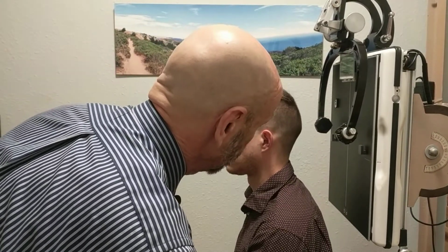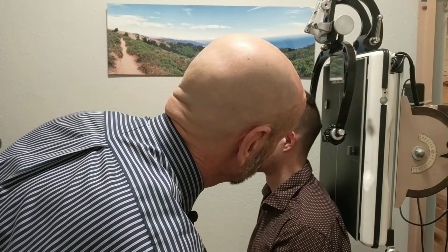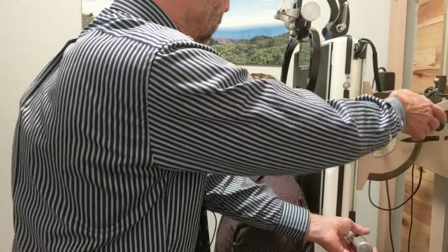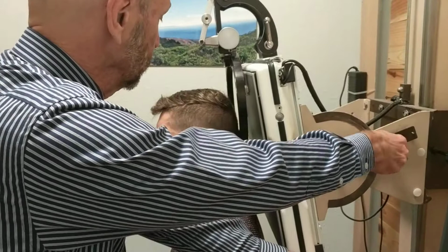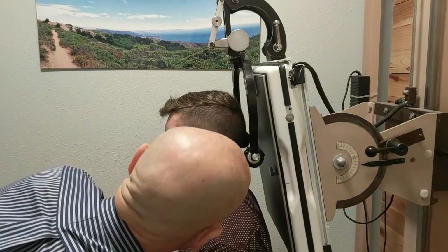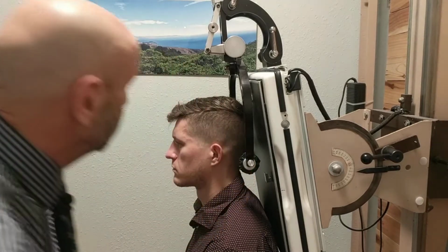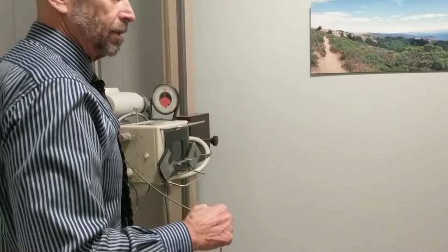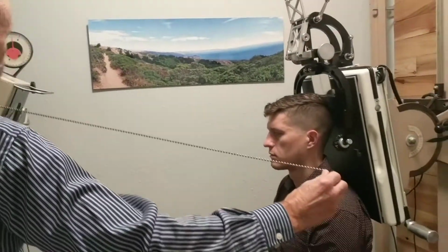But the patient is once again asked to sit in his or her normal posture, and what we're going to do is bring the patient in until something touches, be it the head or the shoulders first, and then the tilt of the bucky has to match the contour of the patient's back. And so what we do is we want to make sure that the head and shoulders touch at the same time. And the patient can be instructed to not lean against the bucky. That's important.